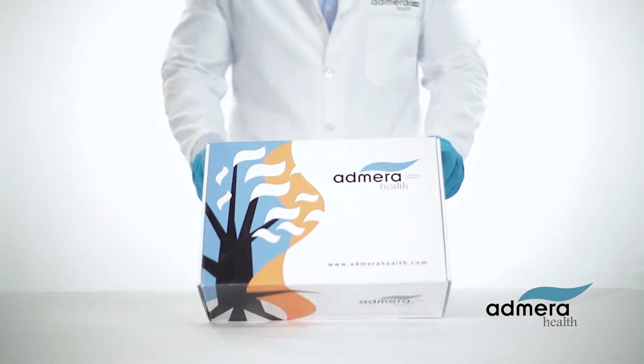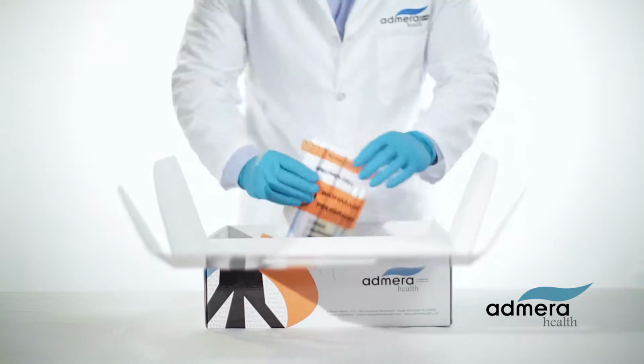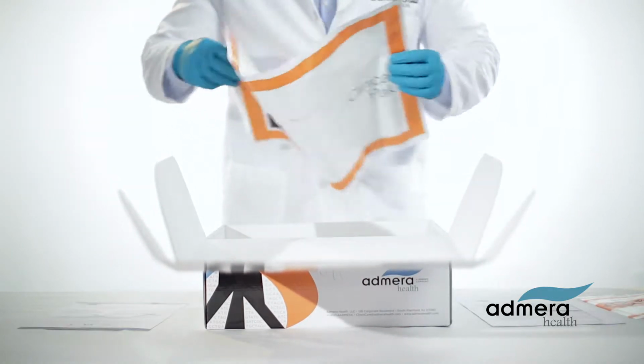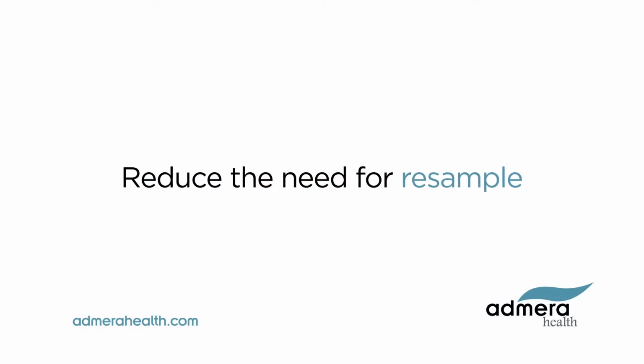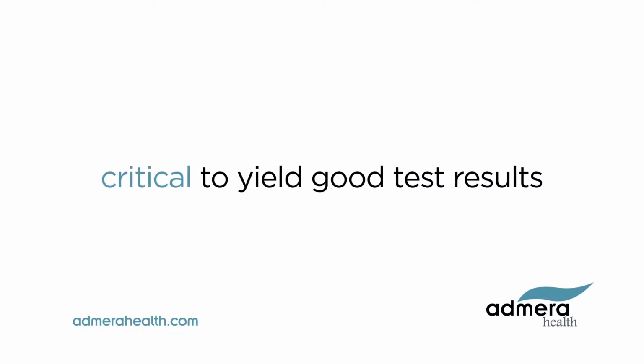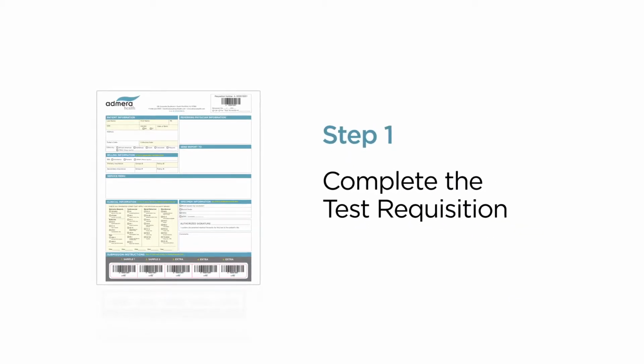The following video will review proper techniques for collecting a buccal or cheek swab sample for processing in our laboratory in 3 easy steps. This will reduce the need for resample and is critical to yield good test results. Step 1. Complete the test requisition.